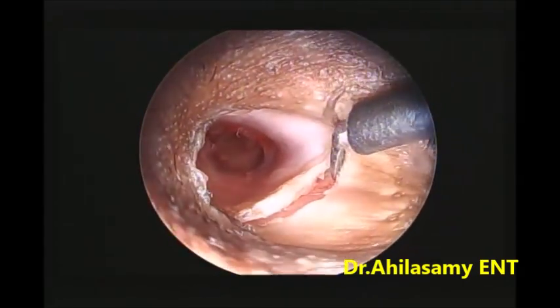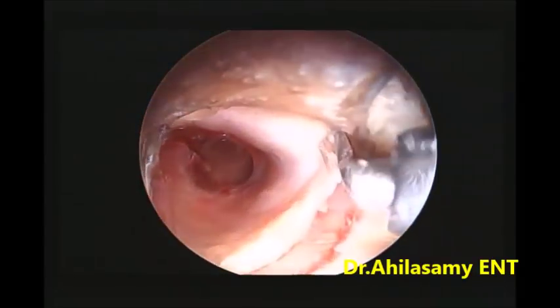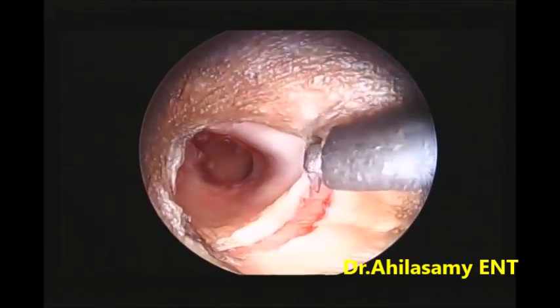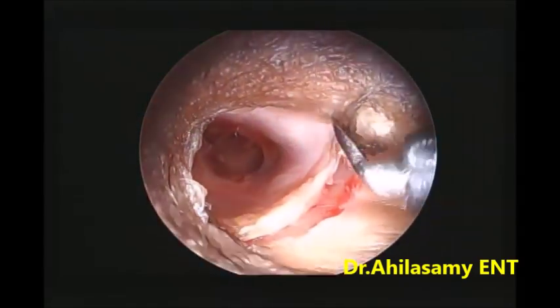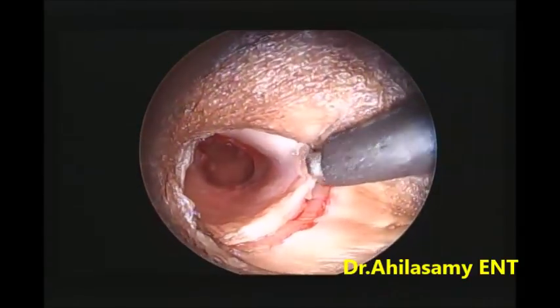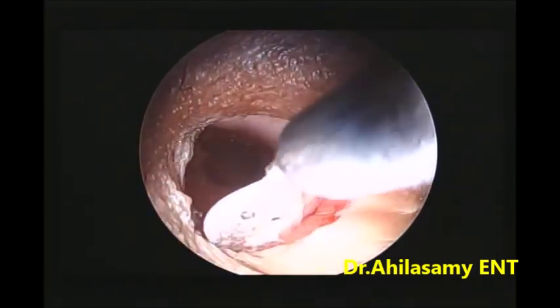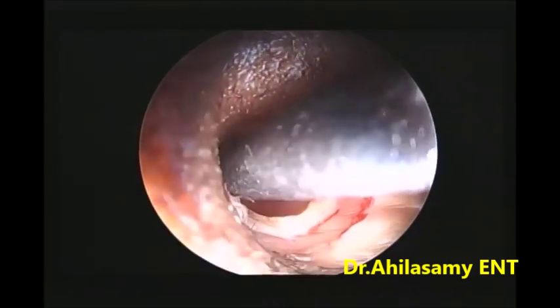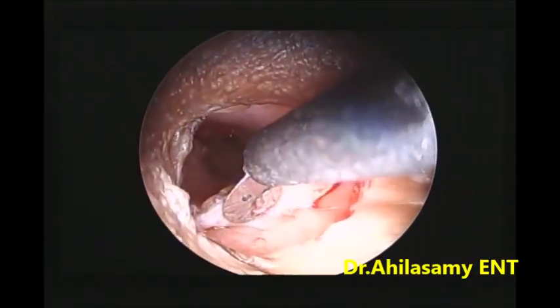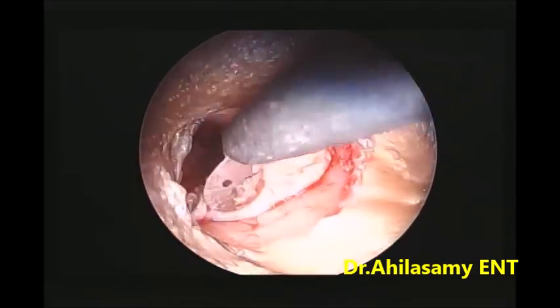If there is some bleeding at some places, I use the monopolar mode to cauterize that area. You get a wonderful field — no need for suction, no need for a second hand. That is the biggest advantage, and this will be a game changer in endoscopic ear surgery. See the lovely field — this is what we couldn't get in the initial days.